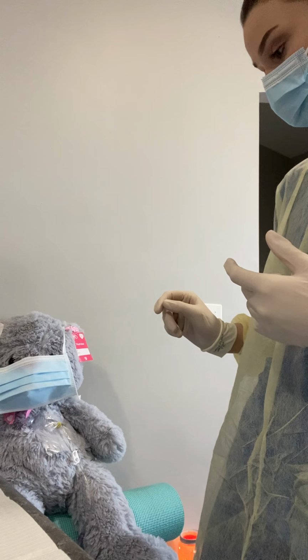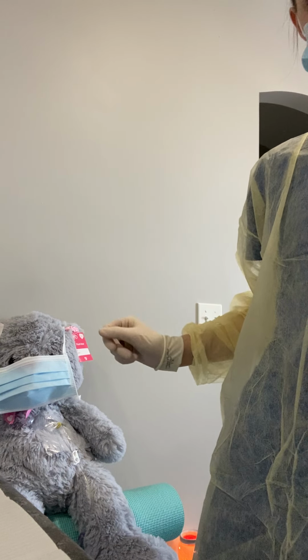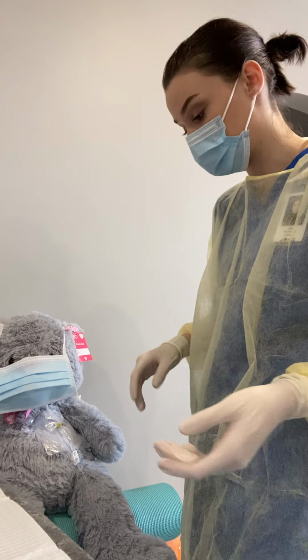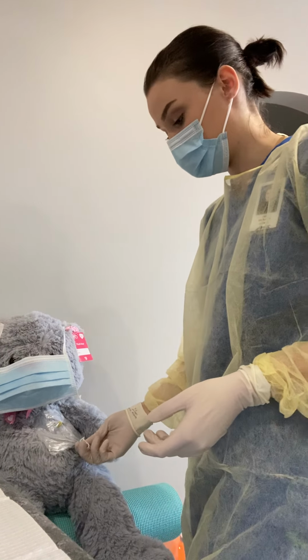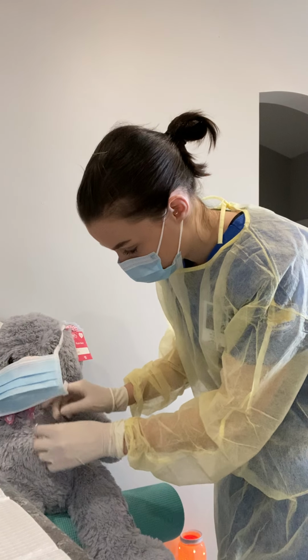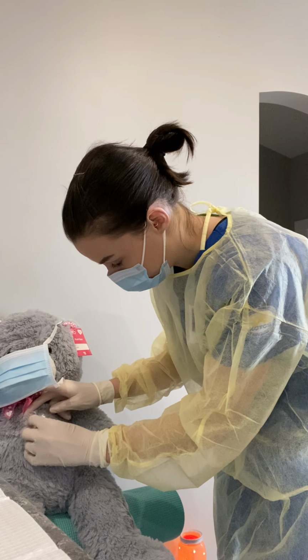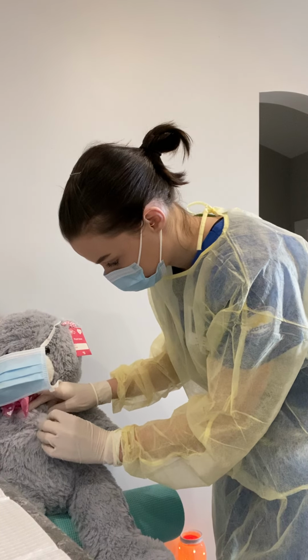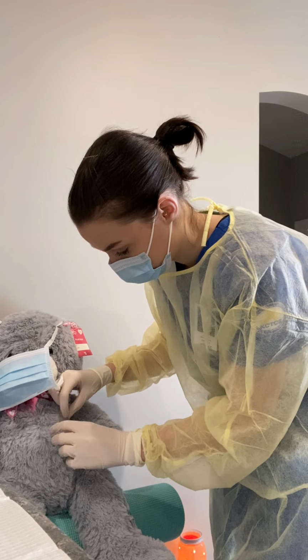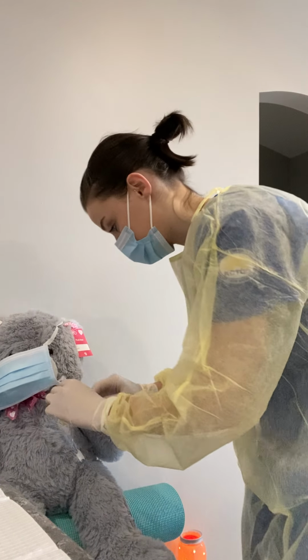So for this one, I'm going to go ahead and pull back the Tegaderm, loosen that, stop the IV fluids that she had running. If she had any running, I'm going to stop that, clamp, and I'm going to go ahead and pull back this dressing, which, you know, I don't know how well this is going to work to take off of this tape there. Okay, there we go. So we're going to pull from out to in, loosen that up.